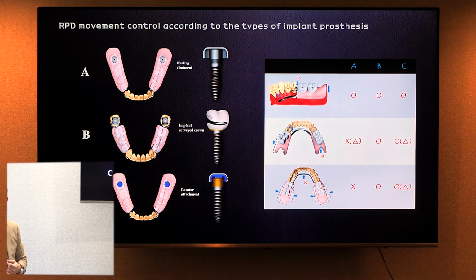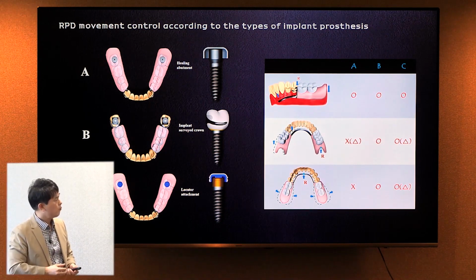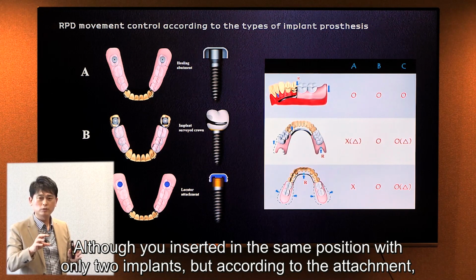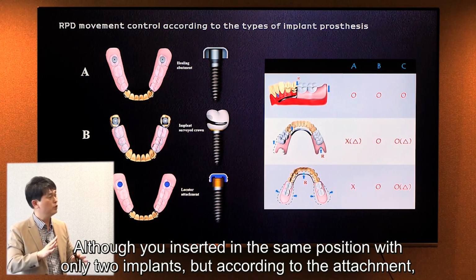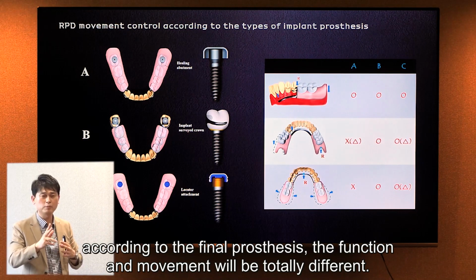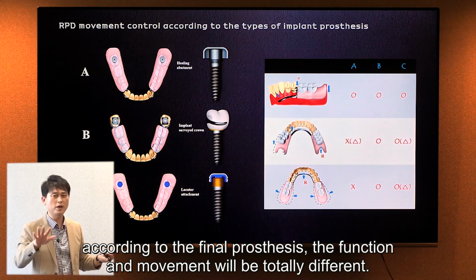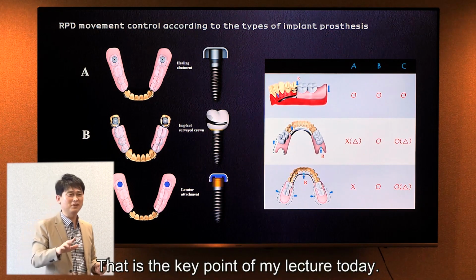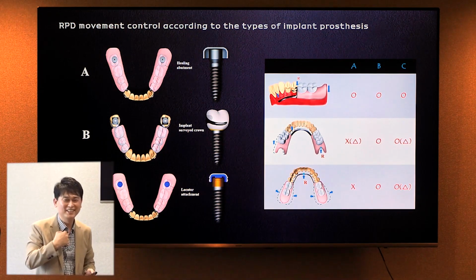Okay? So although you insert only 2 implants in the same position, according to the attachment and the final prosthesis, the function and the movement will be totally different. That is the key of my lecture today. Yes, okay.